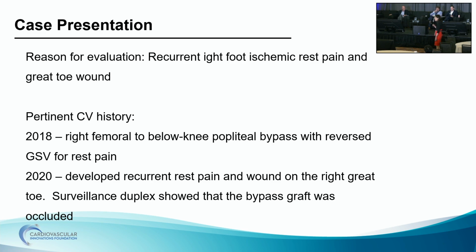Oh yeah, I think definitely. Actually, that patient had already thrombosed that graft before, and in the previous rendition of this story, we lysed it. And then this graft had been kind of petering along for a while, and we highly recommended bypass graft revision, but he declined that a couple of times. But that distal anastomosis, I think, was the culprit. I mean, in this case that was presented, he could well have had a lysis catheter. He was not acutely ischemic. He had this non-healing wound, but a lysis catheter would have been totally reasonable there.